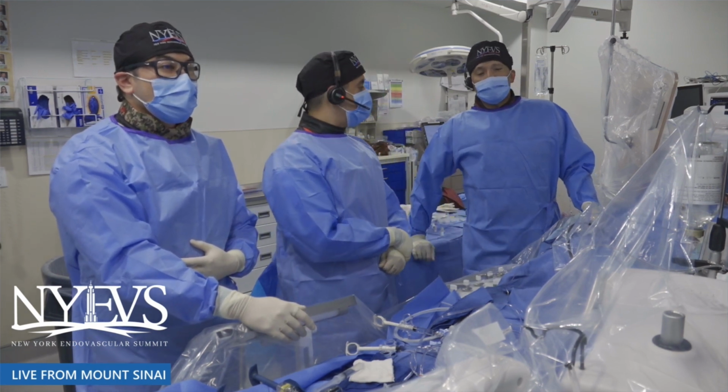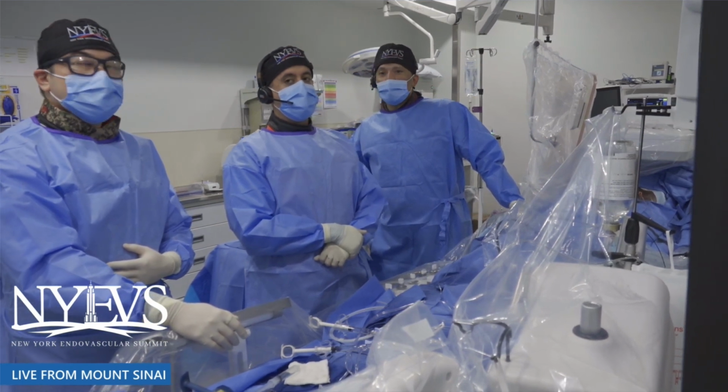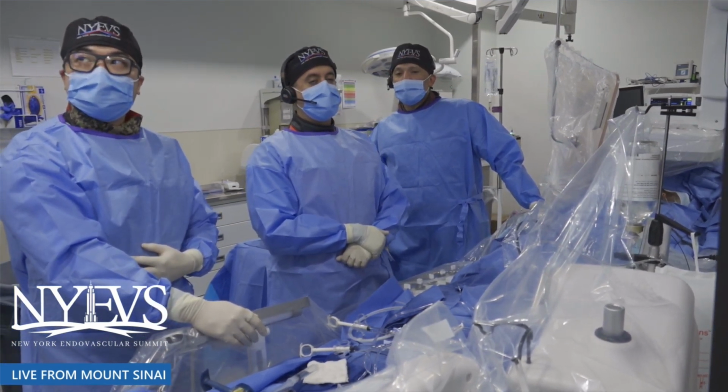Right. So is there any specific IVUS criteria you guys use to say this needs shockwave, this does not? Is there like 90 degrees, 270, or 360?